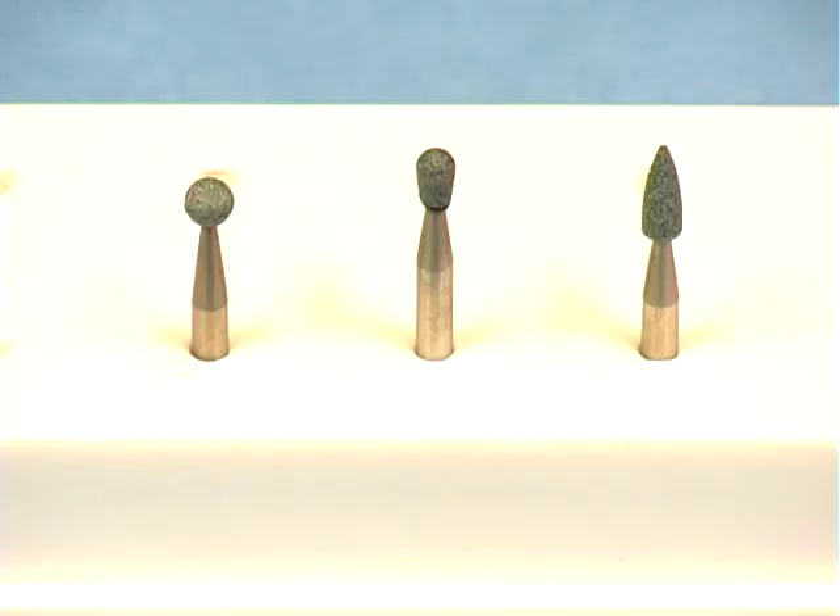An abrasive green stone or a large round burr can be used to prepare the surface for polishing. A rounded end is preferable to avoid putting grooves in the occlusal surface of the amalgam.